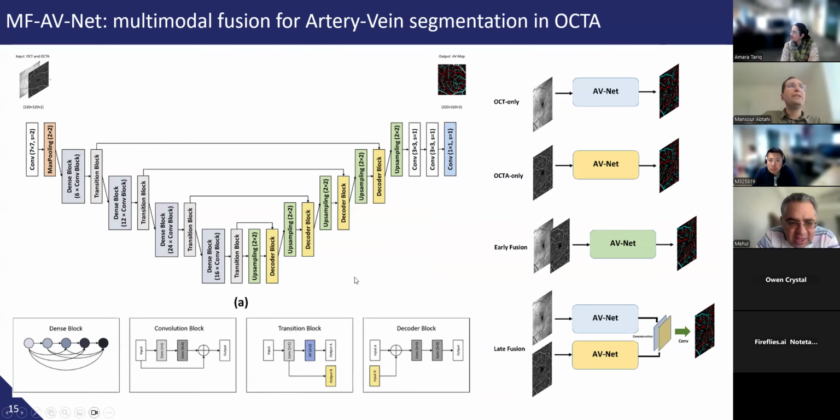In this study, we didn't design the architecture of the model. We used a DenseNet architecture for the process. We were mainly focusing on analyzing the fusion options and seeing which one is more useful, because we had tested before and saw that the DenseNet architecture has better performance compared to other models that we have used before.